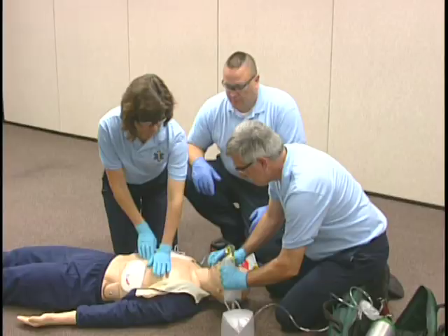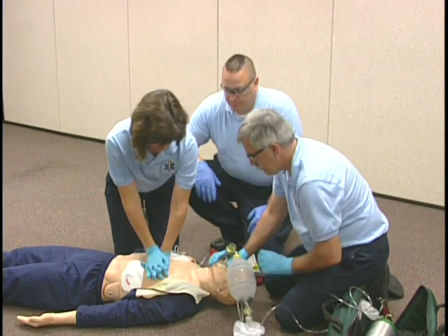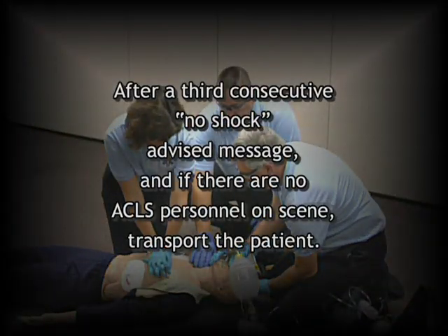If no shock is advised and the patient still has no pulse, resume CPR. After a third consecutive no shock advised message, and if there are no ACLS personnel on the scene, transport the patient.